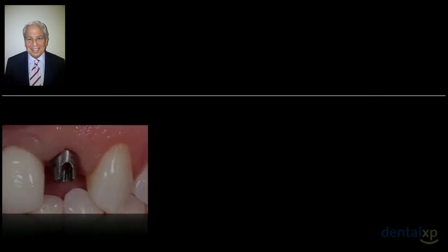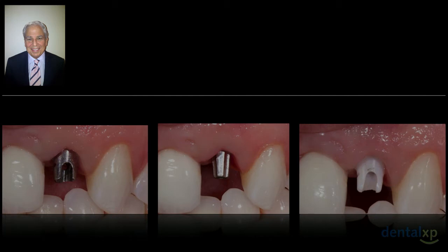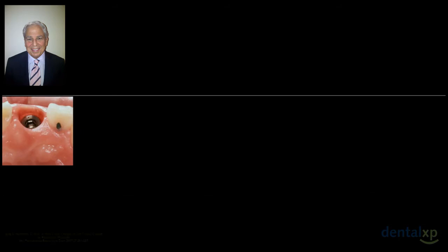And it's important in the anterior area because, as Stephen Chu and Dennis were talking about earlier, we want to see that the color is going to be hidden. So when we have a thicker amount of tissue, it doesn't matter if we have a large titanium abutment, a smaller titanium abutment, or a zirconia abutment. When we highlight that area right above the margin, we hope that we're not going to be seeing any discoloration of tissue. And they gave some great stats this morning about measurements that are very important to us.